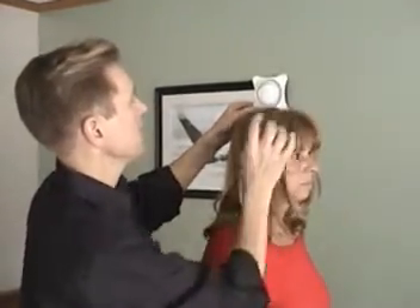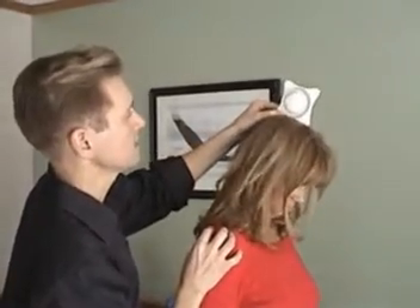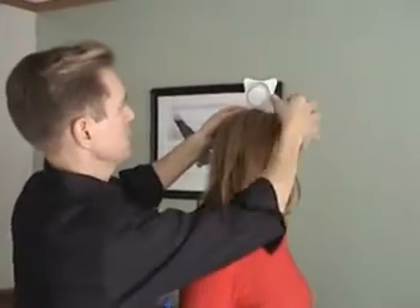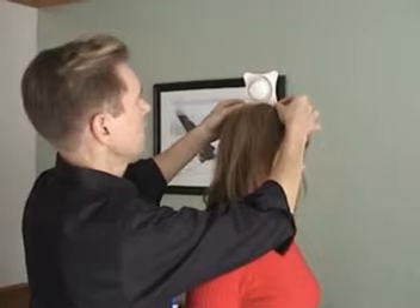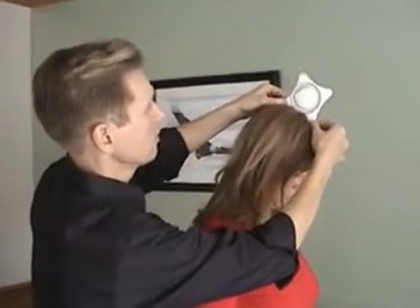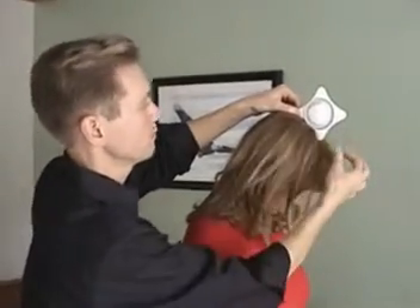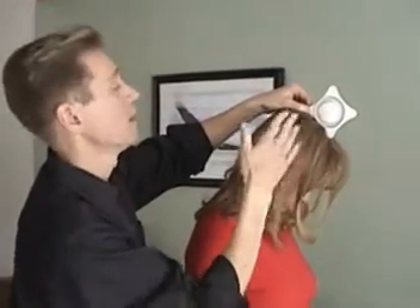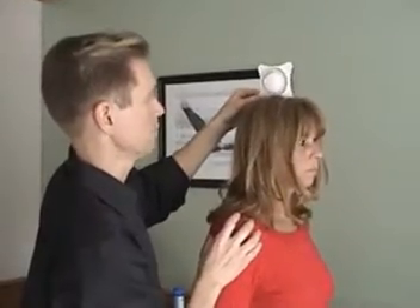If the person moves too quickly and you let the inclinometer slide, obviously you're going to get an errant number. Part of the trick is anchoring the inclinometer on their head, and also following their head forward without influencing it. Don't push them forward, but make sure that the inclinometer does not move in relationship to their head so it stays in the same place — you'll get a more accurate reading.